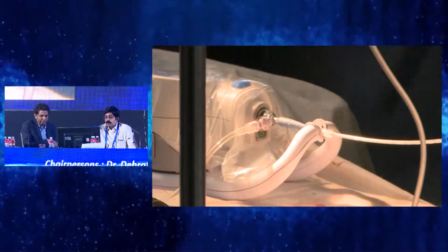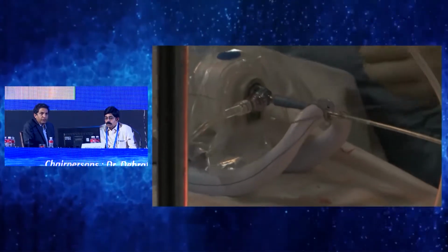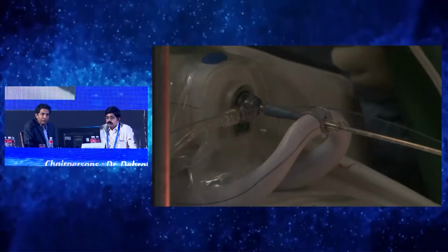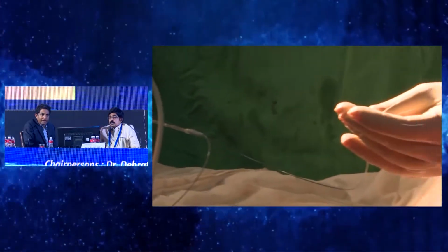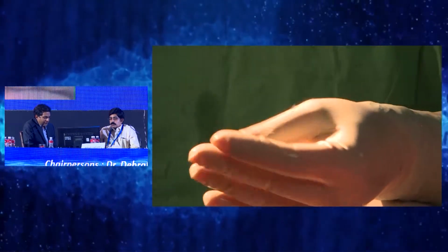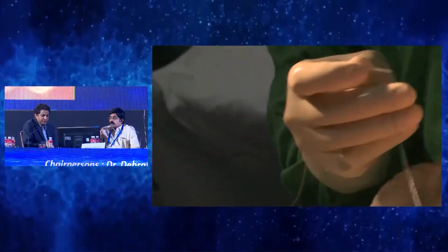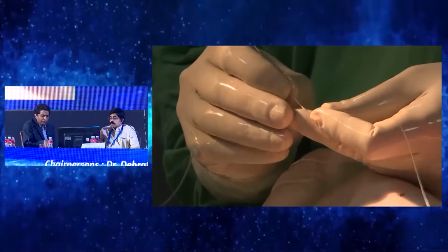I think you have demonstrated excellently how CTO can be simplified by using certain equipment and dual injection. In the beginning, some of us remember how we used to tackle CTOs, which is not the same as we do nowadays. Even though we might think that this is a simple right CTO, by doing dual injections we can minimize the amount of contrast.